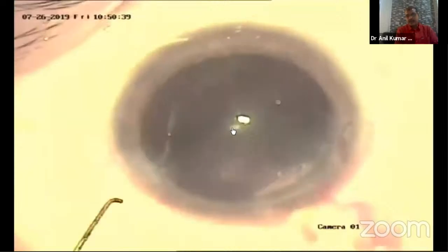This is how, after we put the IOL, the trick is not to put much pressure, just a slight screw movement. If two lines are very close, there's a chance of wound dehiscence again.